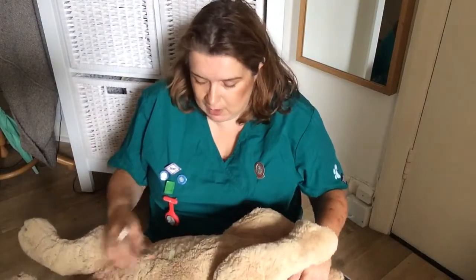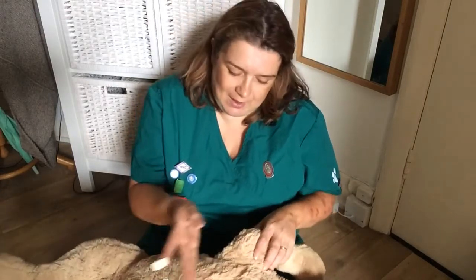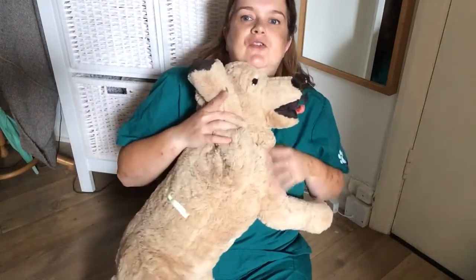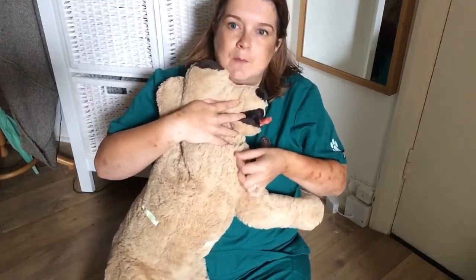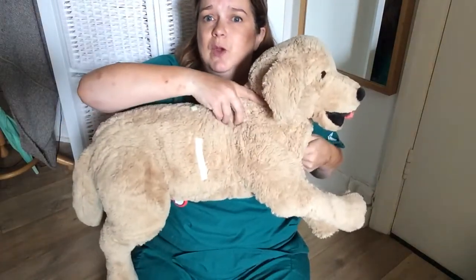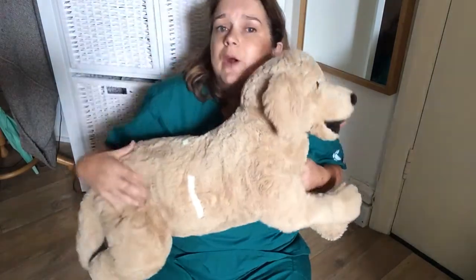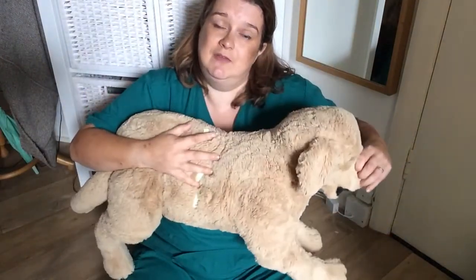It all starts with the lateral thorax. Going forward, we know we're looking for the manubrium and thoracic inlet for our most cranial point, so we know that isn't just straight under the dog's legs because the dog actually has a nice curve of a chest coming up. So our manubrium is going to sit in about here — remember that if you get a DV, don't panic, because to include where we just put this you are going to have to do a bit of the back of the dog's head. Do not worry about that because that's what you normally do; it's just in normal patients their head would be lying slightly flatter so it wouldn't feel so bad.